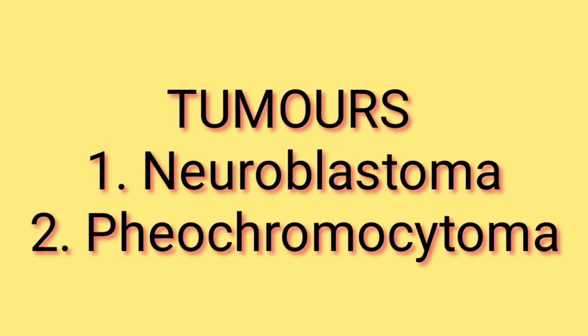Today I'm going to talk about adrenal gland calcification. While you are reporting a CT scan or MRI, or sometimes it is likely possible to see it on ultrasound imaging, while there is any tumor. There is a wide differential diagnosis for adrenal calcification.